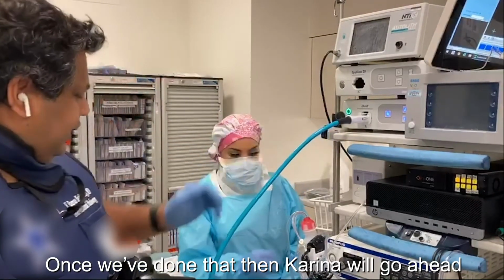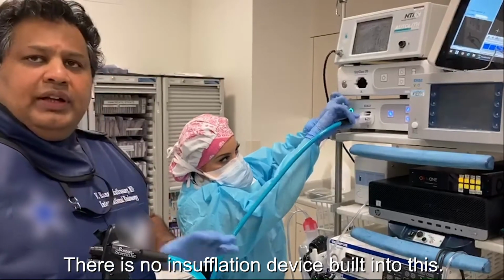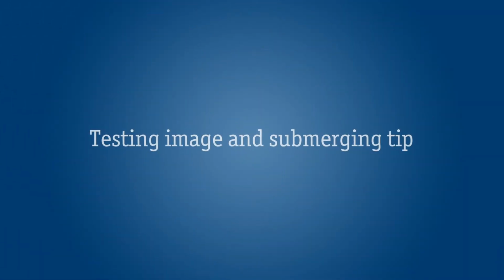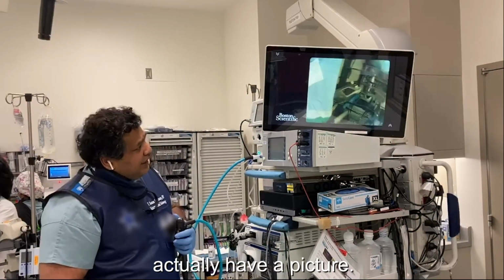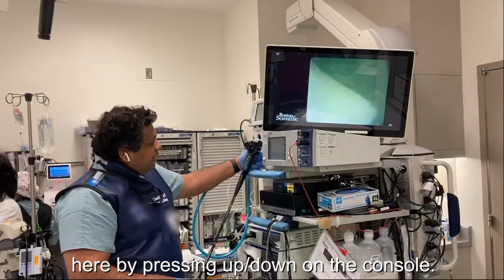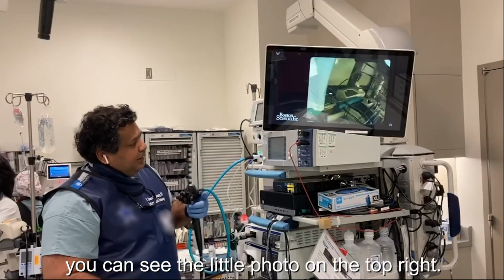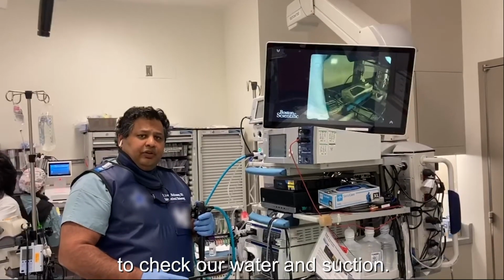And then once we've done that, Karina will go ahead and hook us up with our suction and air water. There is no insufflation device built into this, and so therefore you'll need a separate one, usually a CO2 insufflator is what I'd recommend. And then of course we have the suction. So after we plug this in, we confirm that we actually have a picture, and you can see my finger here, okay, and I can control the brightness of the image here by pressing up and down on the console, so you can see it gets a little brighter or not here, and we can check an image capture. You can see the little photo on the top right, so we are able to take our pictures here, and then the last step will be to check our water and suction.